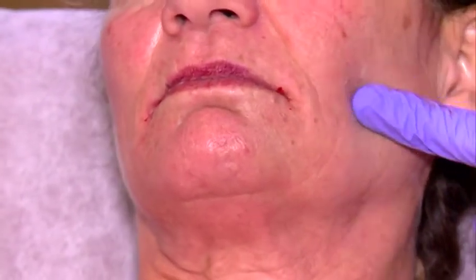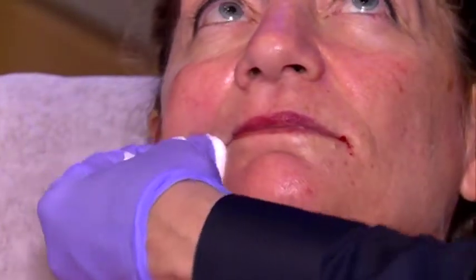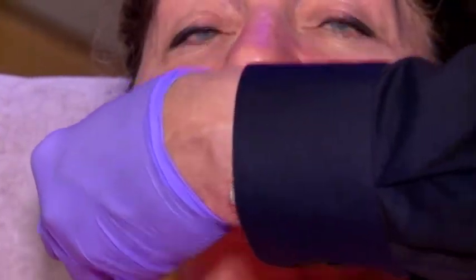I cannot push it up 1 centimeter because of gravity and anatomy, you know, we have a ligament here, which always prevents it. If you do a facelift, like this, I'm simulating it here, you see not much lifting effect anymore. So even with a facelift, you would not have much benefit on the corner of the mouth. And this was less than 1 cc, which is almost nothing. What I could do with the rest, I'm not sure.